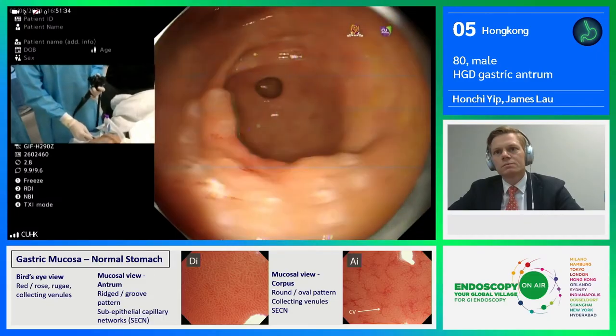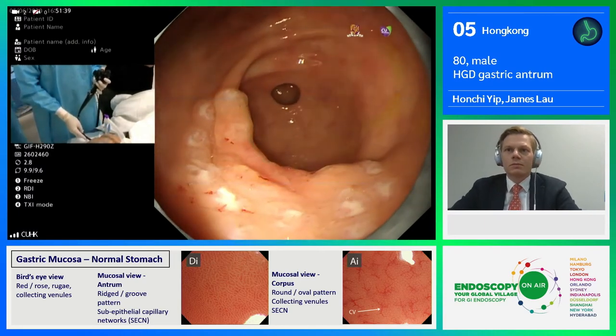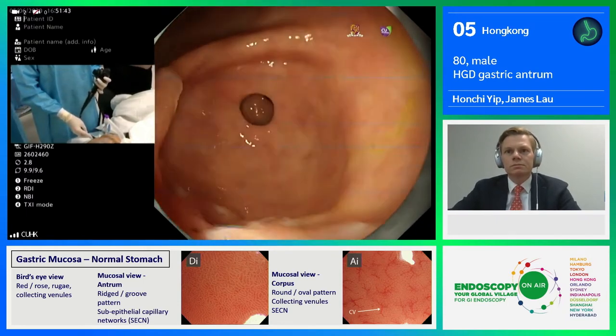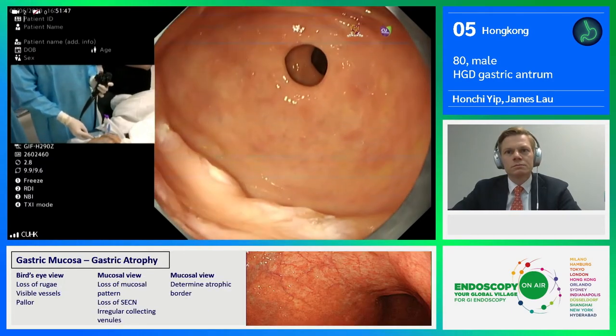Most part of this lesion, at least at the edge, is slightly elevated, as you can see, at around 9 to 10 o'clock region. But the center of the lesion appears depressed. I would say this is the PARIS 2A plus 2C lesion.